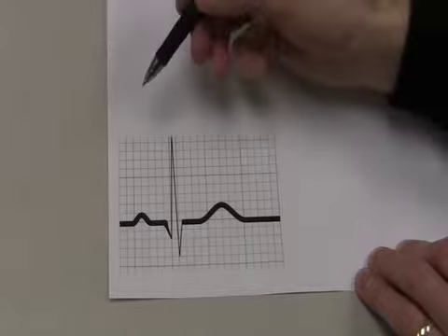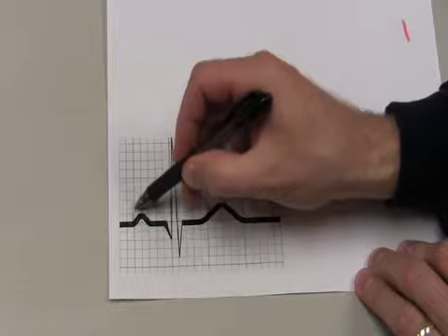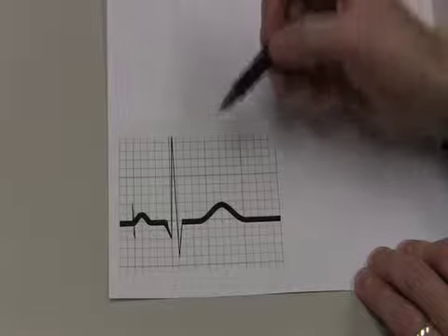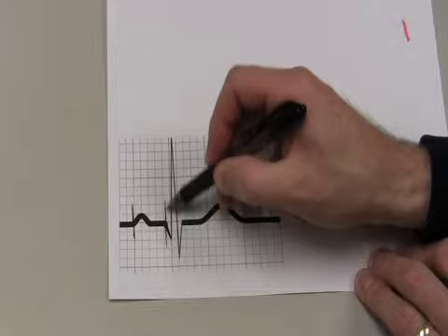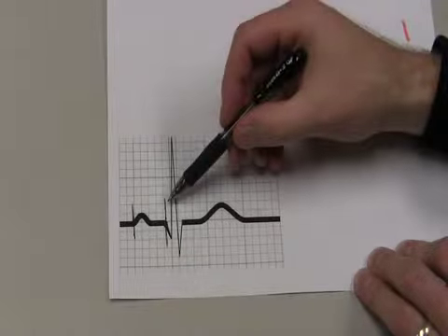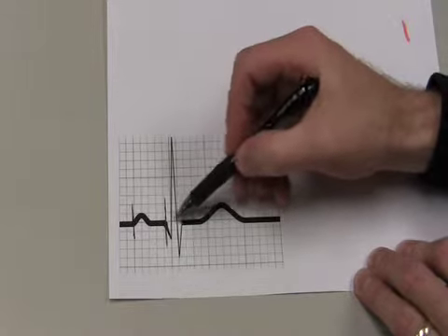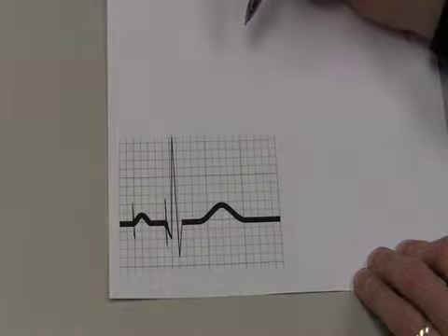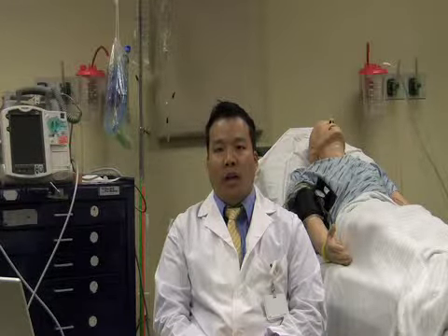An individual with a pacemaker, whereby the pacemaker is firing in the atria, one might notice a pacer spike just before the P wave. If there is also a ventricular pacer, there will be a second pacer spike just before the QRS complex. Although because the pacer spike is generating contraction in the ventricle, this QRS complex is typically wider when the ventricular pacemaker is firing. Pacemaker firing may potentially be confused with any widened QRS.